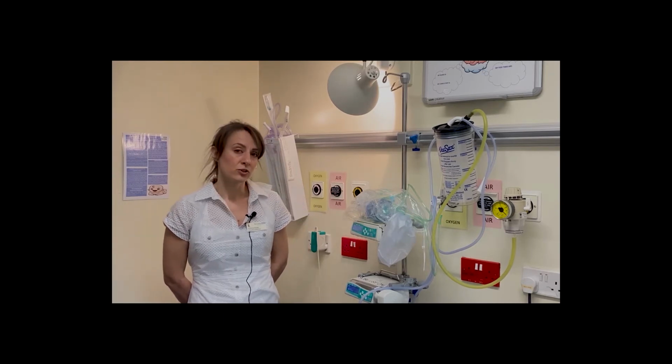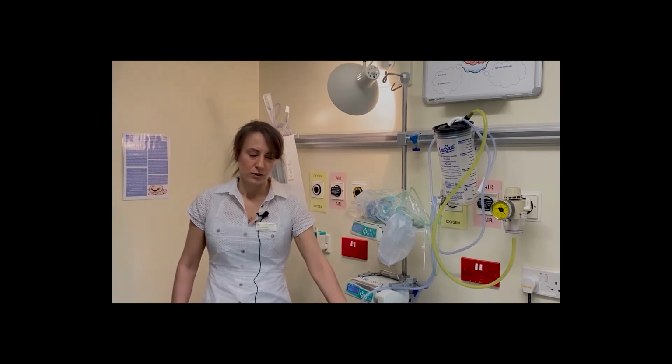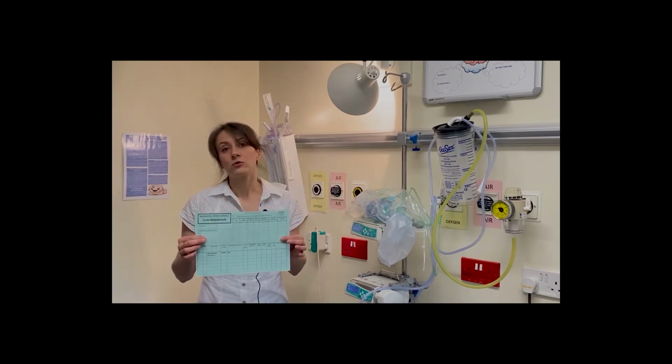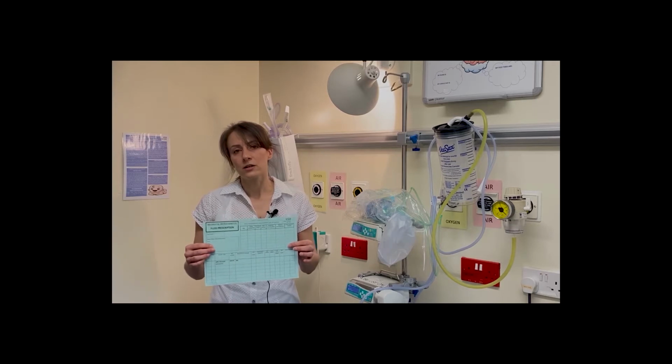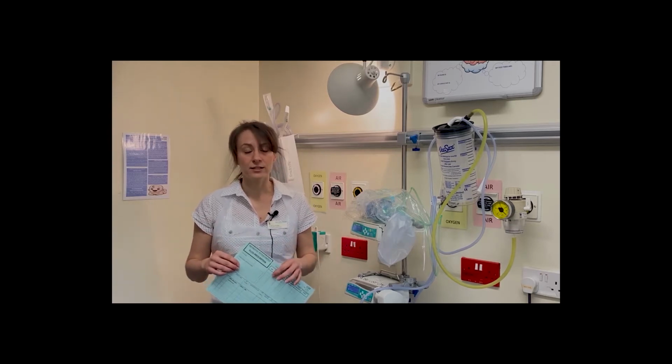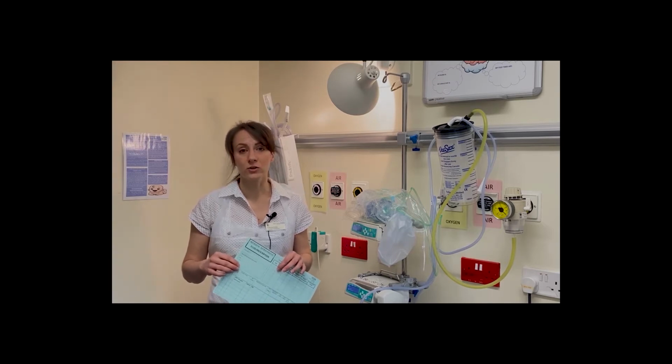Secondly, make sure that you've prescribed the fluids. We use these fluid prescription charts. Either do this yourself or delegate the task to somebody else so that the nursing staff can prepare the infusions and have them ready to connect as soon as the lines are secured.